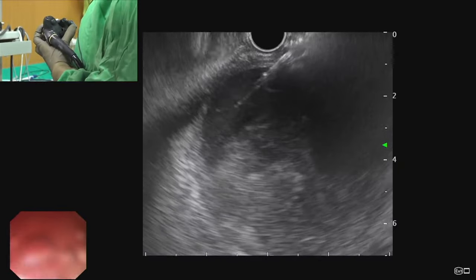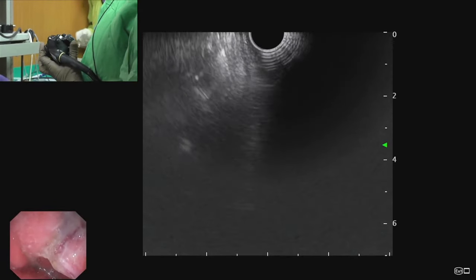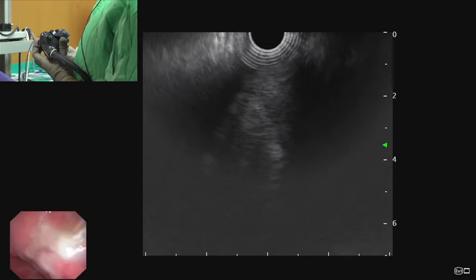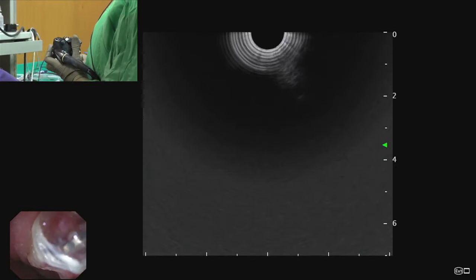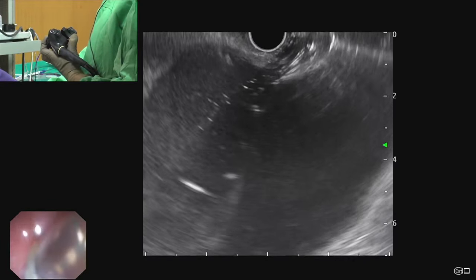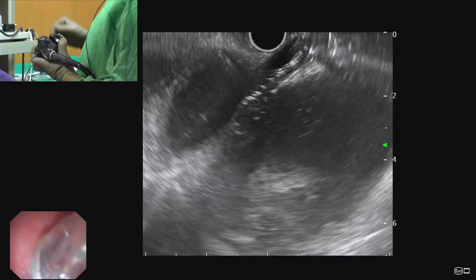To obtain endoscopic vision, the required movements are: big wheel down, then anti-clockwise torque on the shaft, and a slight pull back. We keep half the balloon inside and half outside the walled-off necrosis. On fluoroscopy, we confirm obliteration of the waist and dilatation of the gastric wall. On both endoscopic and endosonographic vision, we can see the balloon is inflated, confirmed also on fluoroscopy.